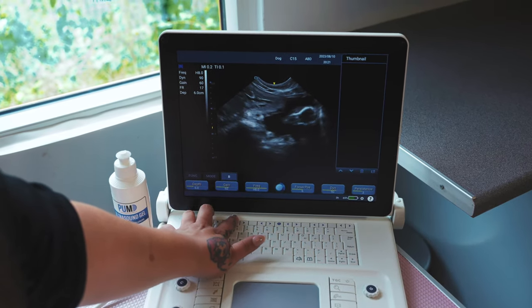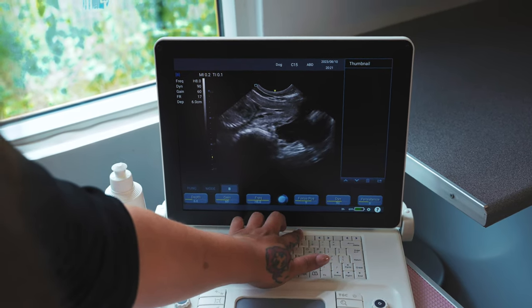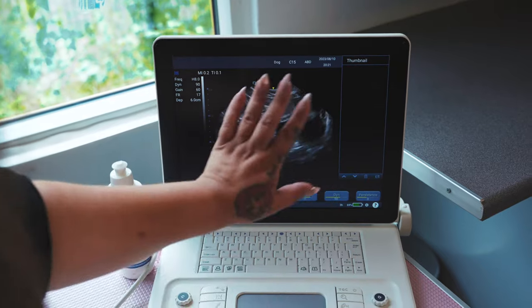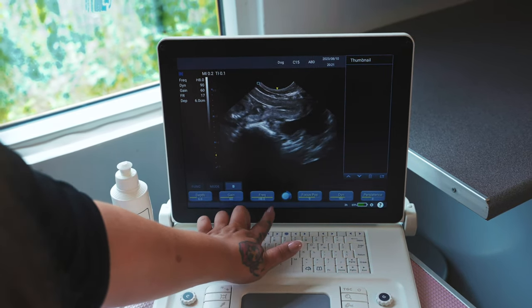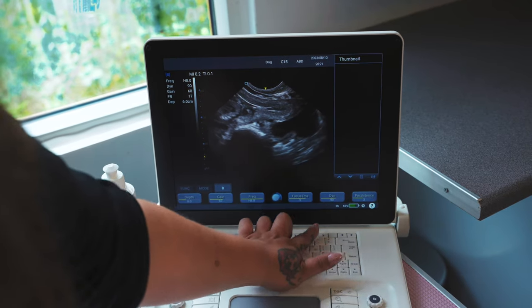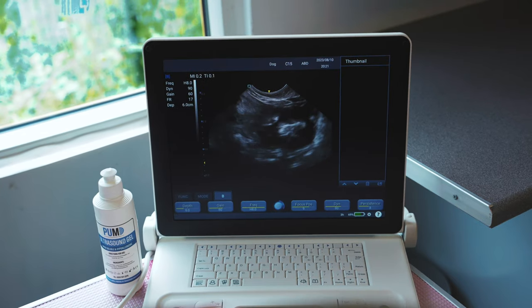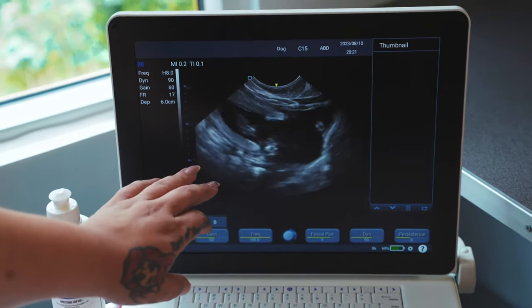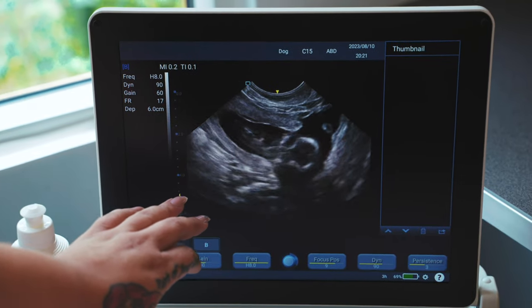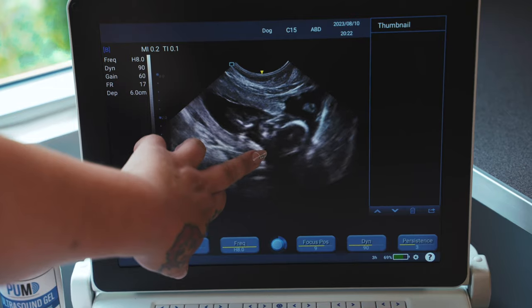I'm just changing some of the settings so that we can get a really nice clear view. It's really simple to use this machine — just use the arrows beneath the settings you'd like to change. Now the settings are a bit better.